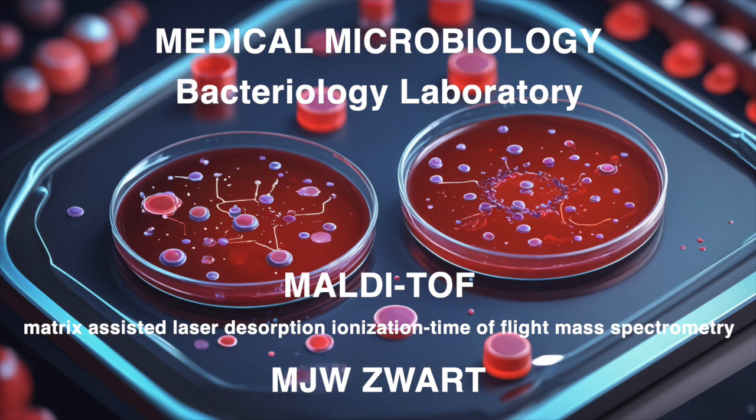So it's quick. Simple. It is, but it doesn't work for every single microorganism. And that's where the extraction method comes in. Exactly. Some bacteria and yeasts need a little extra oomph to release their proteins. Right. So the extraction method uses specific reagents, like formic acid, acetonitrile.